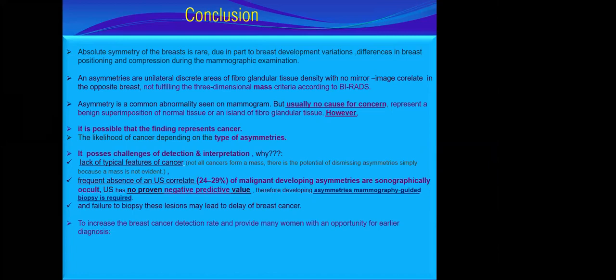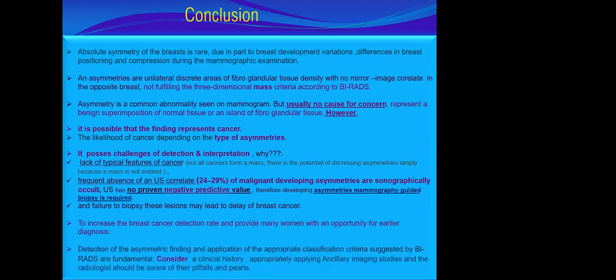To increase the breast cancer detection rate and provide many women with the opportunity of early detection of breast cancer, we need to follow the appropriate classification criteria suggested by BI-RADS, detect asymmetric findings, and apply these lexicons, considering the clinical history, appropriately applying ancillary imaging studies.